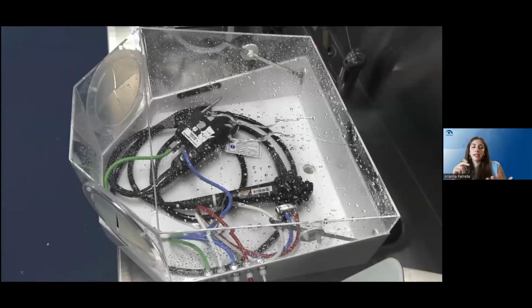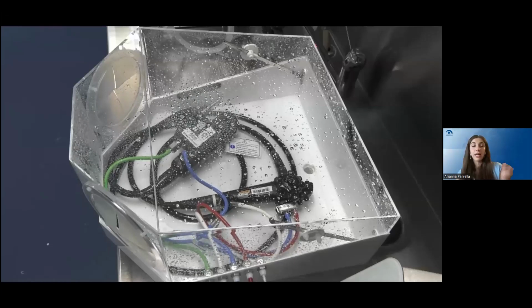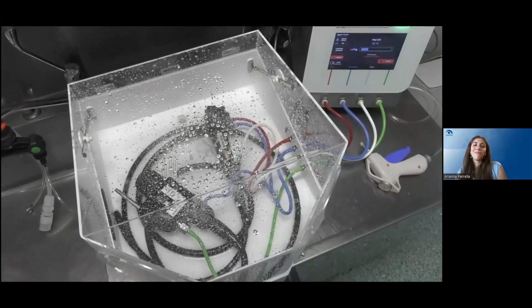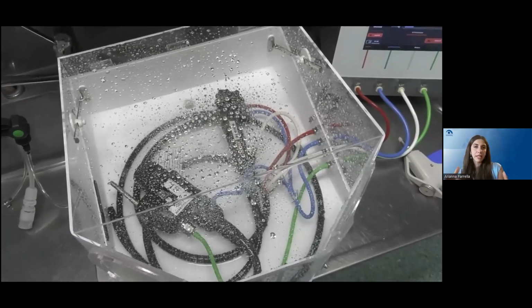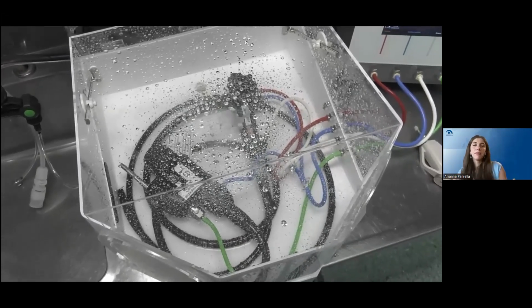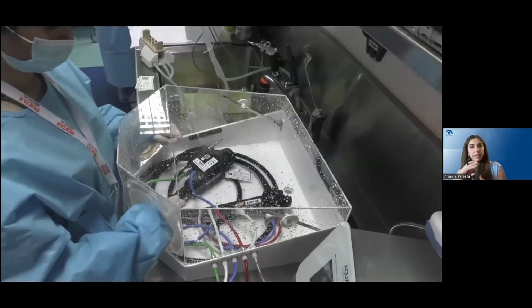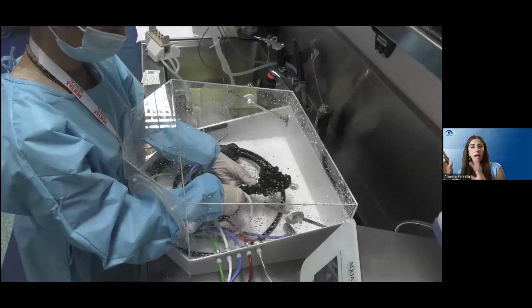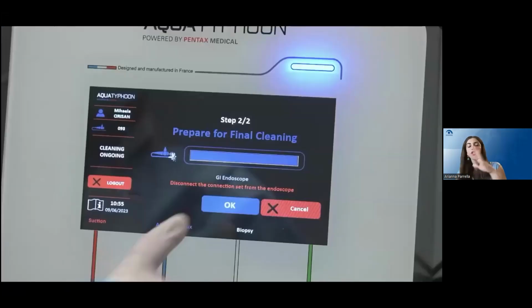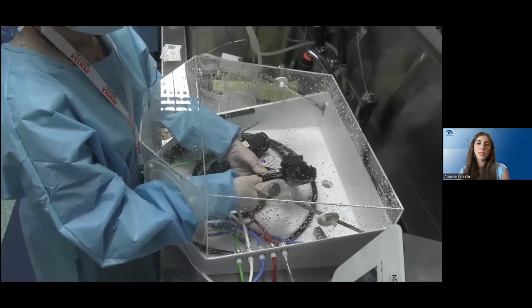And you have just seen that you don't immerse the endoscope, you don't brush or wipe the endoscope. So all the repetitive and forced movements are no longer done. Clearly, at the end of this phase, in reality, some organic residue may have been deposited on the outer surface of the endoscope. So we cannot immediately proceed with high level disinfection. Before that, we need to clean one last time the outer surface of the endoscope using the aquajet gun. So we disconnect the endoscope and we repeat the same phase again. We take the aquajet gun, we start cleaning from the bottom section and then from the cloche to the tip. After that, we are ready to proceed with a high level disinfection, as you can see in this video.